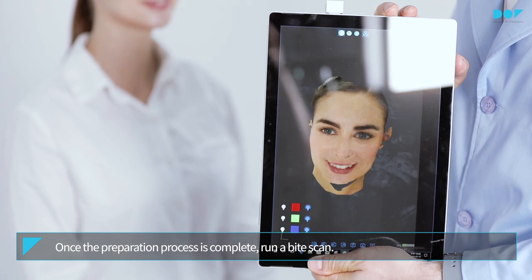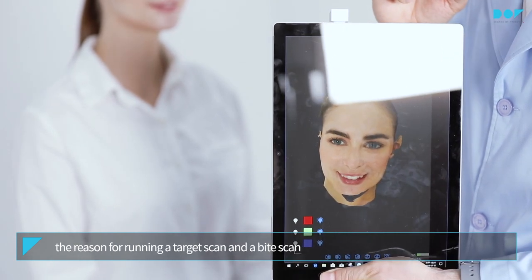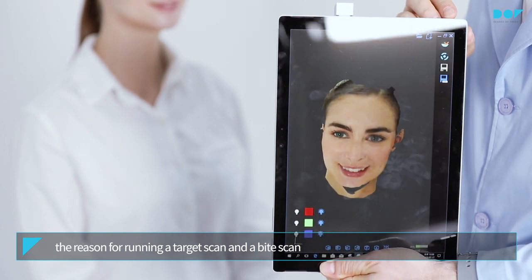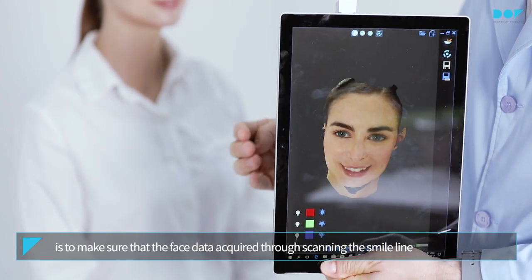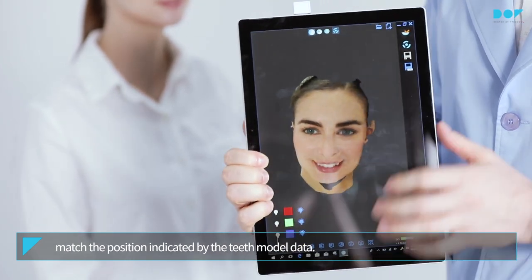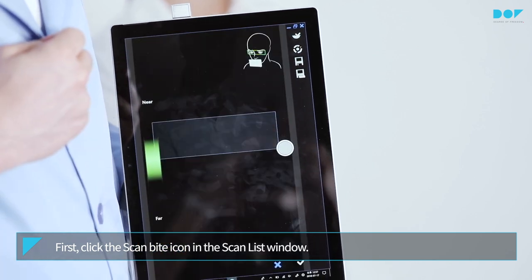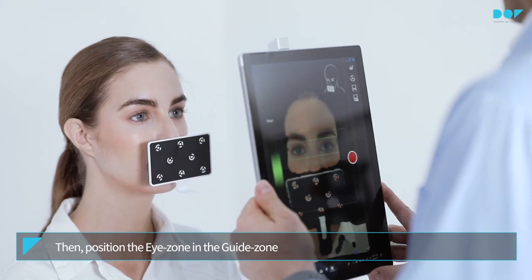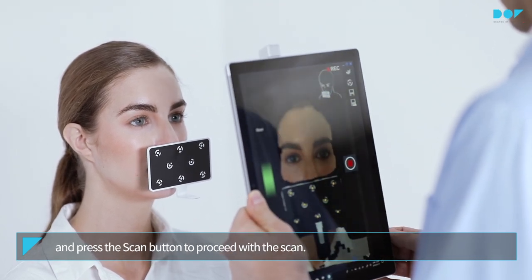Once the preparation process is complete, run a bite scan. The reason for running a target scan and a bite scan is to make sure that the face data acquired through scanning the smile line match the position indicated by the teeth model data. Click the Scan Bite icon in the scan list window. Then position the eye zone in the guide zone and press the Scan button to proceed with the scan.